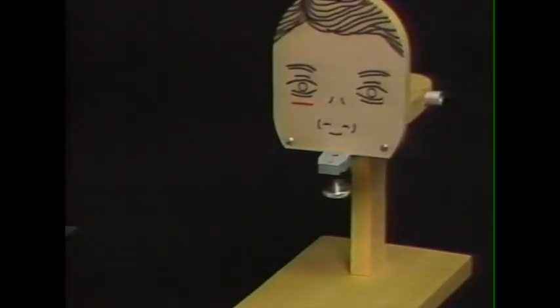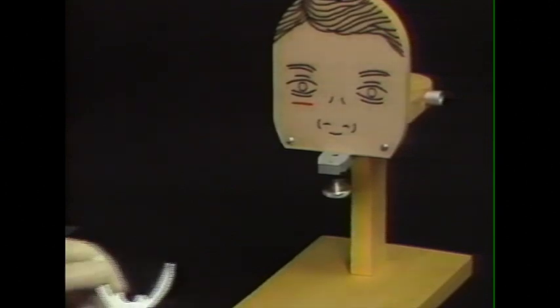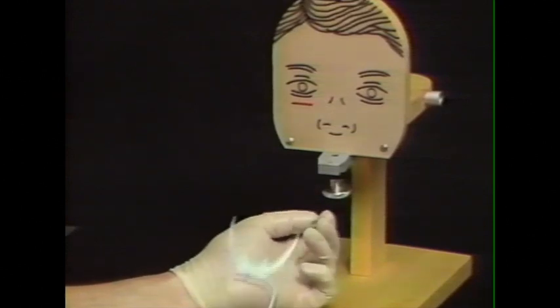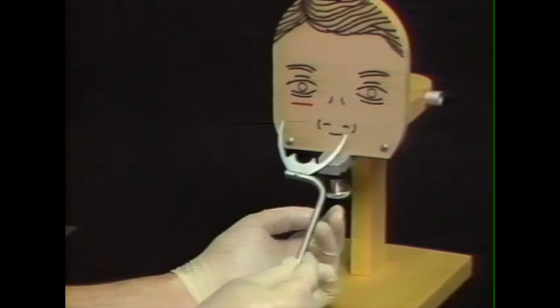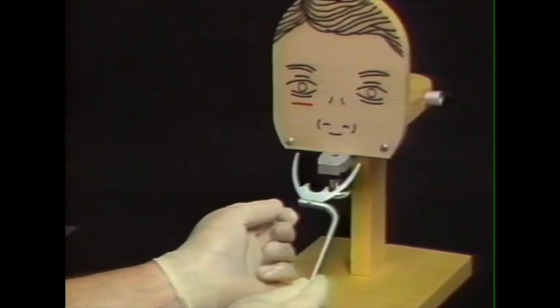To illustrate the use of the component parts of the Facebow, we're going to introduce you to Harvey, who is a mannequin set up to train individuals in the use of the Facebow. Harvey has a maxilla here that consists of a clamp to which the Facebow fork can be placed. The fork is always oriented with this brass rivet on the top here in the upward position.